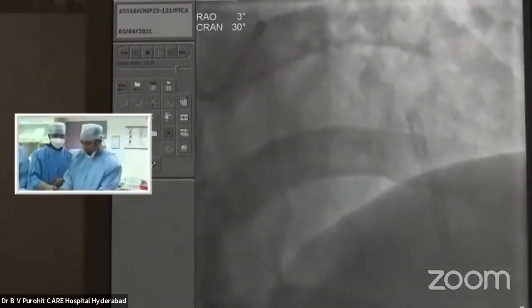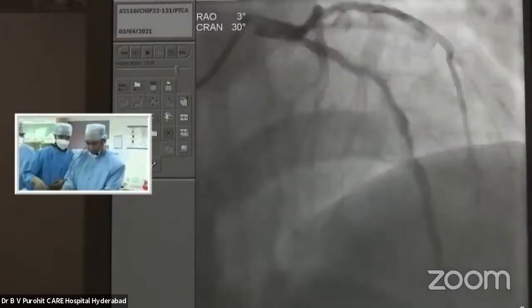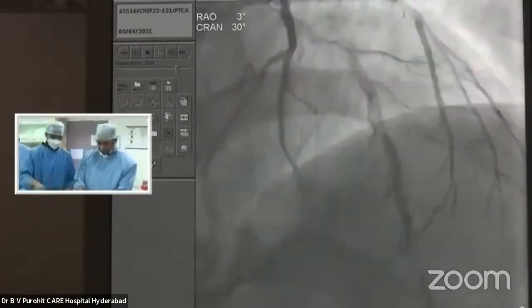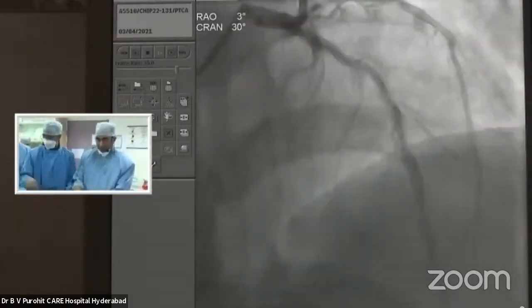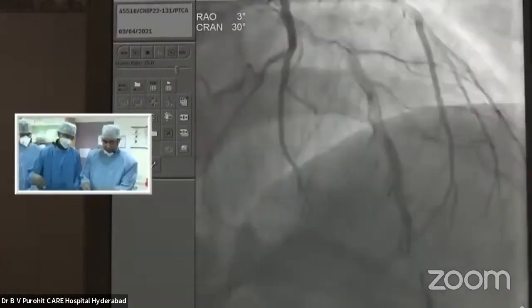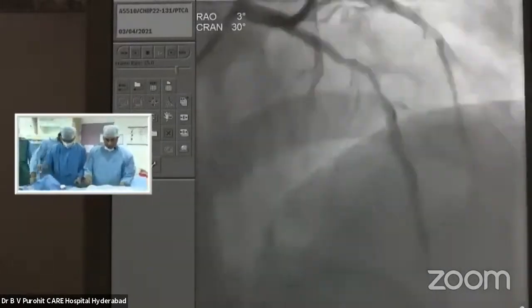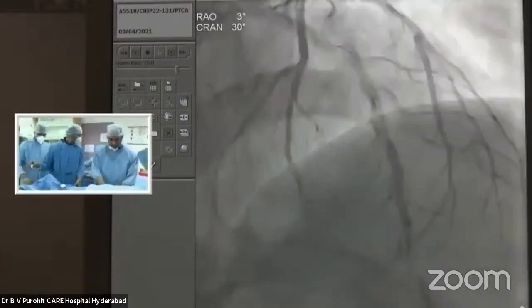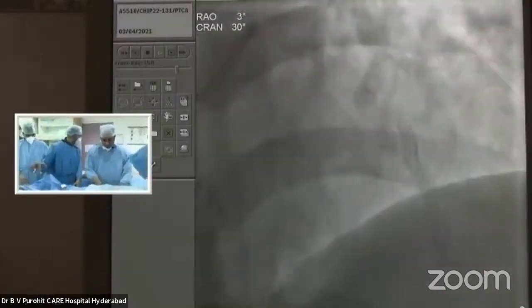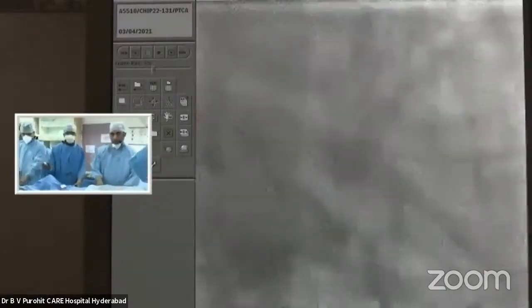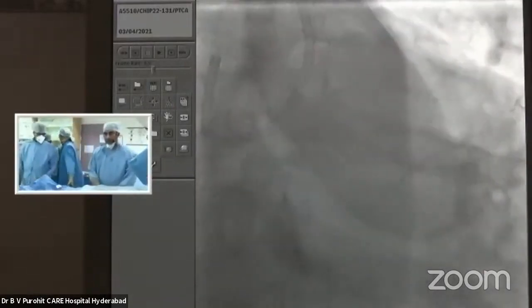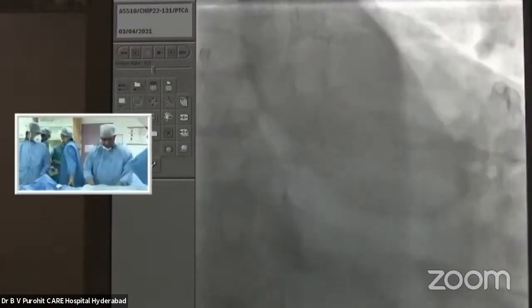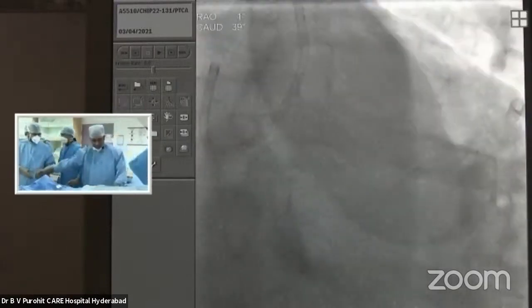I will cross the lesion with the wire and then try to advance the OCT catheter to see whether it can cross this tight lesion or not. If it doesn't cross, I will dilate it a little with a 1.5 or 2 mm balloon and then take a shot. Please feel free to discuss with us during the procedure.